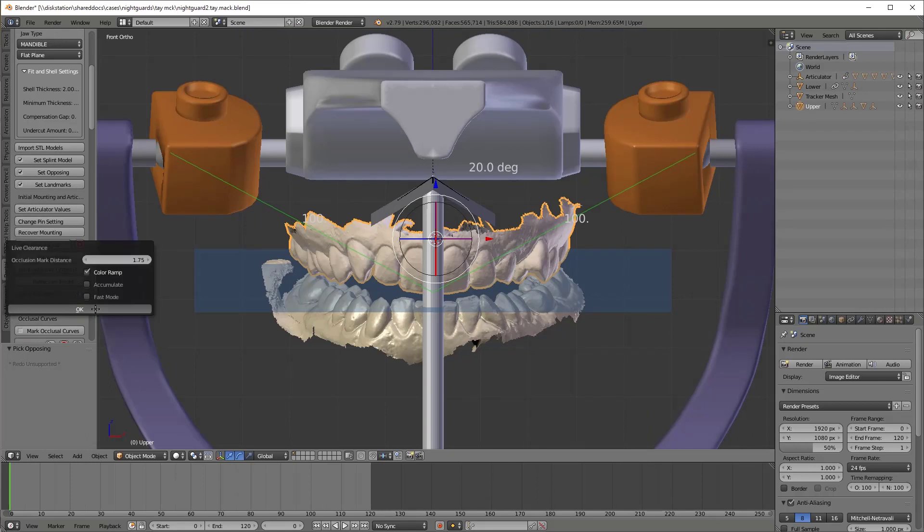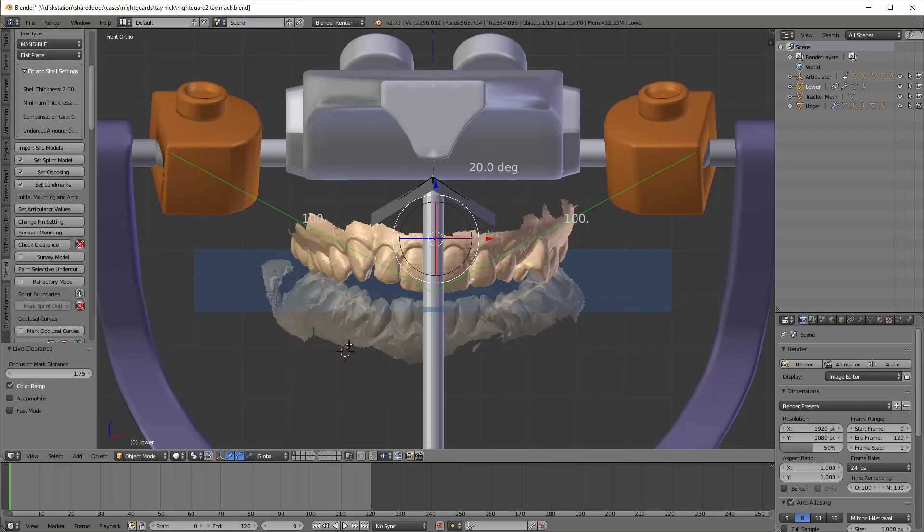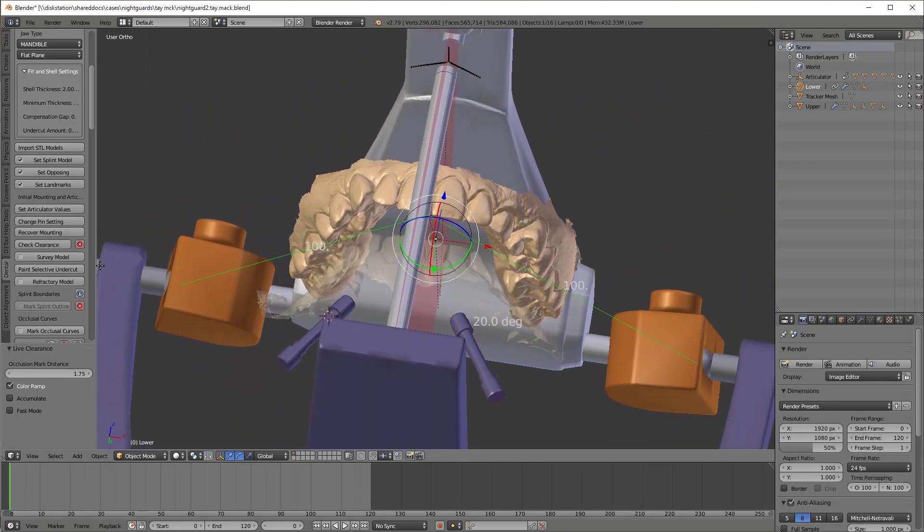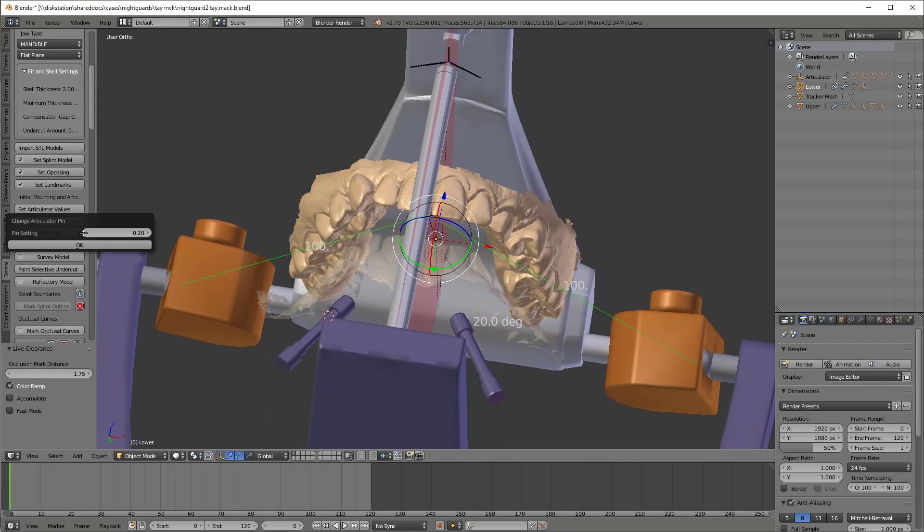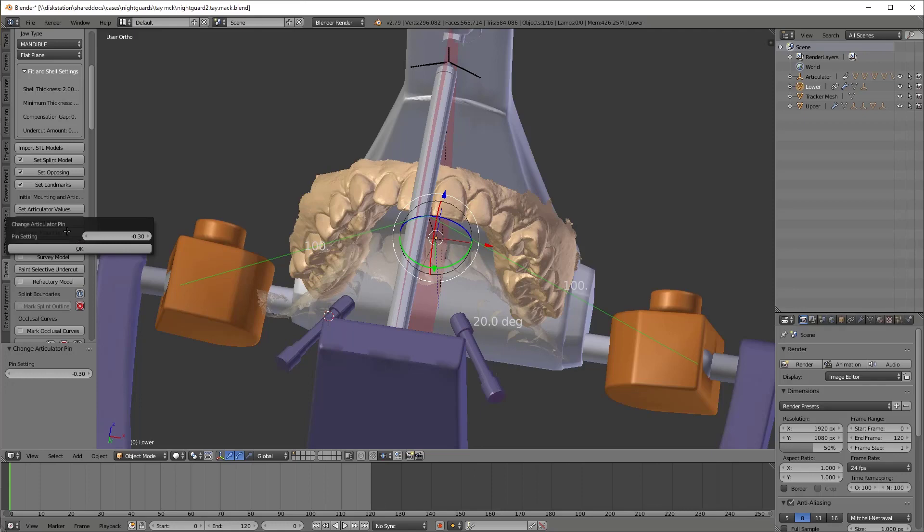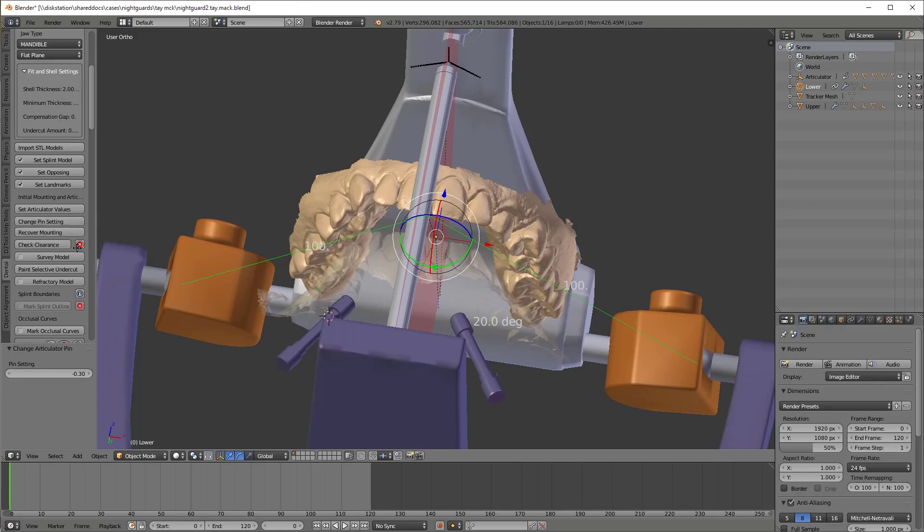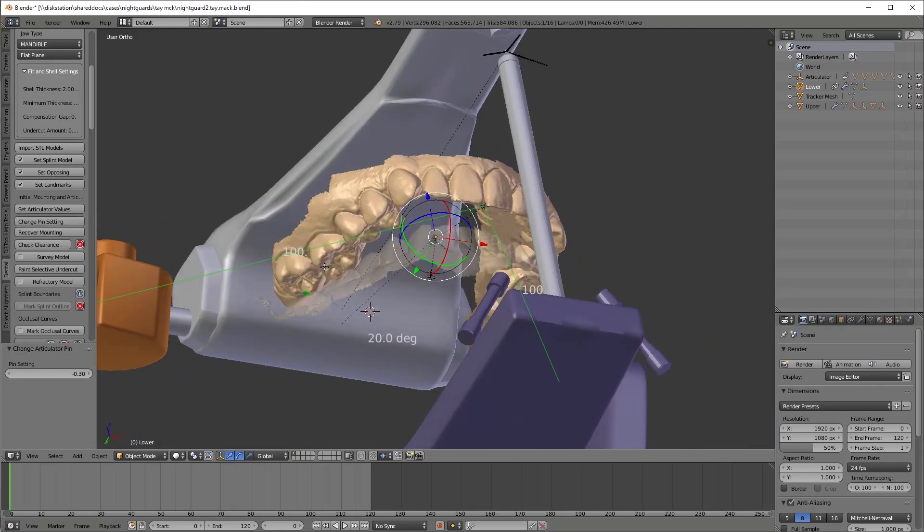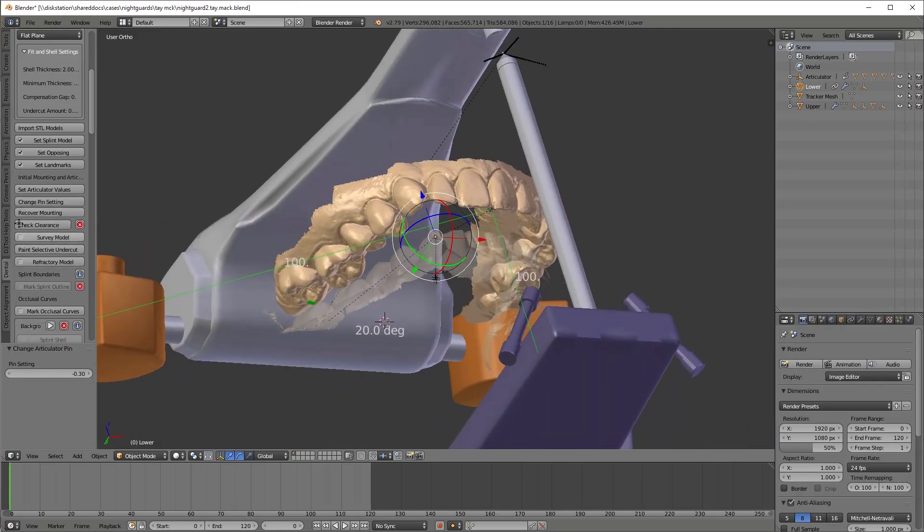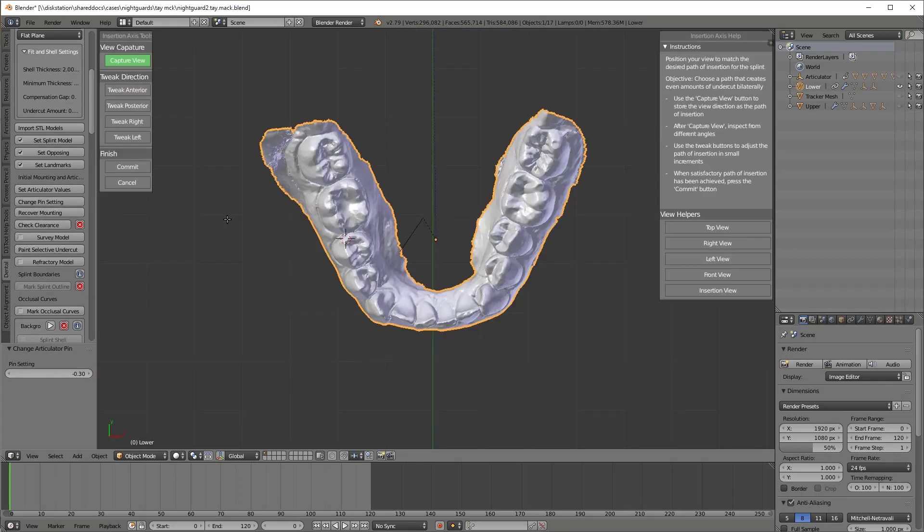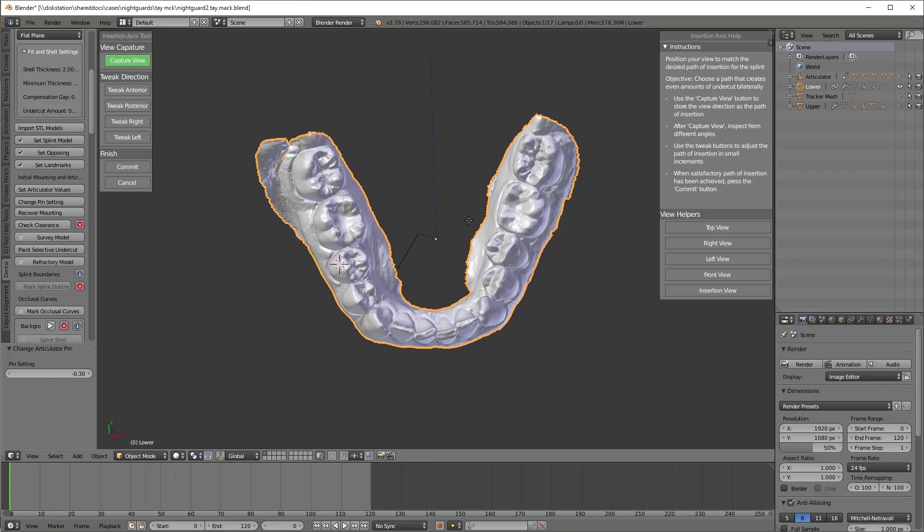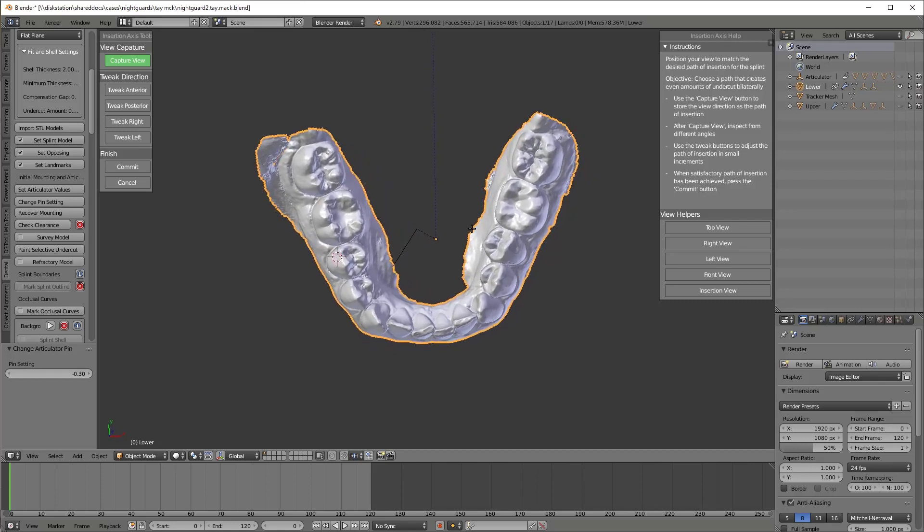And now we're going to go ahead and check for occlusal clearance. In this case I didn't have any green marks, which means I'm not within 1.75. The patient's slightly over-opened. So I'm going to hit a negative compensation and fix that a little bit here. We ended up dropping the pin about 0.6 millimeters there. I got one last green dot. That's fine for me. That's all I want is the first green dot to show up. That means we've got the patient pretty close to where we need to be opening-wise. We don't want it to be any bigger than it needs to be.